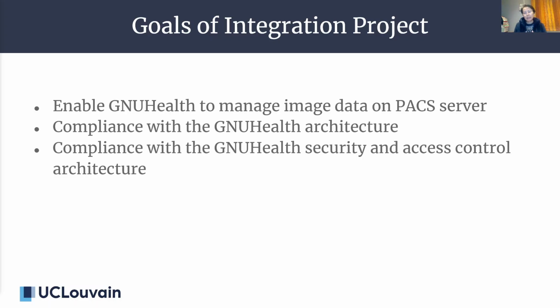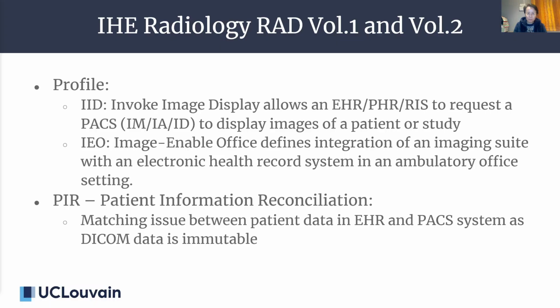We want this integration to feel natural for GNUHealth users. This means they do not have to leave the GNUHealth client for basic tasks, and it ensures that the radiology module aligns with GNUHealth architecture and maintains its security and access control.